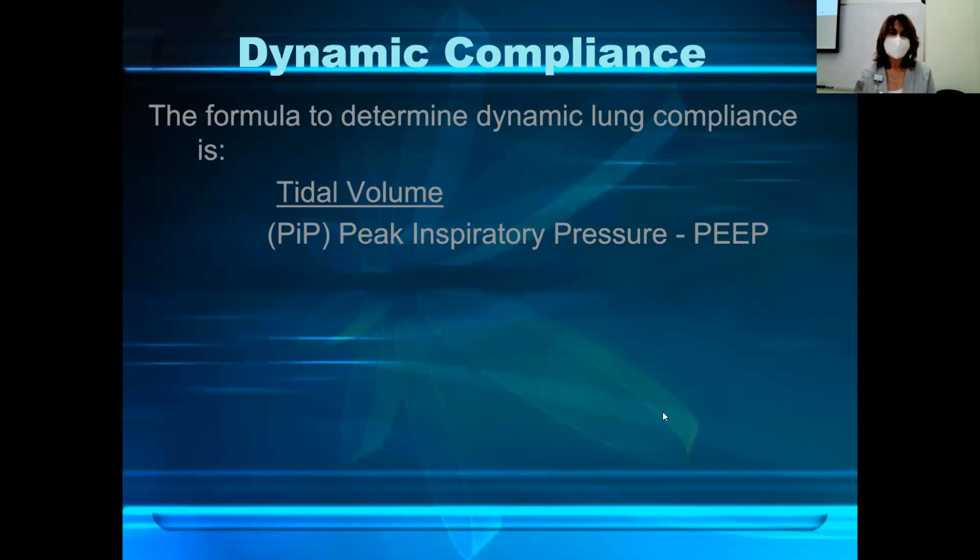Okay, and then it's that same general formula that you use to figure out dynamic compliance. The tidal volume. You need to know the peak pressure and the baseline pressure, the peak.